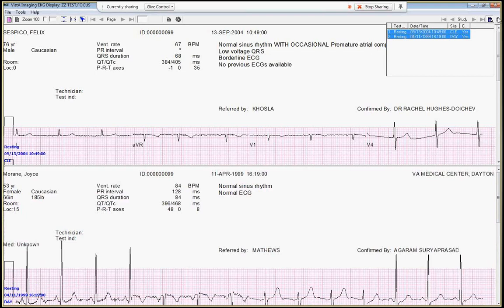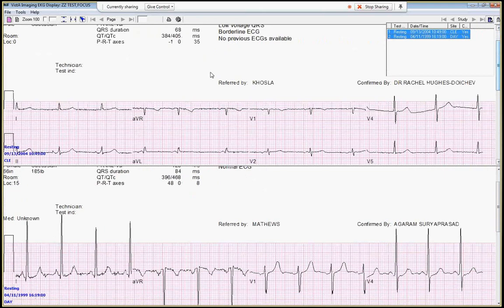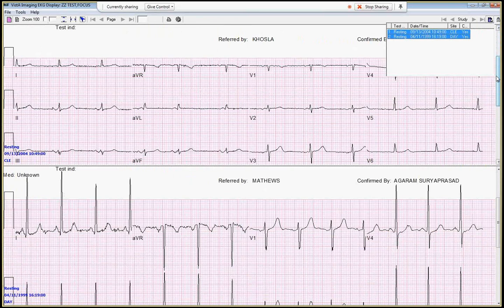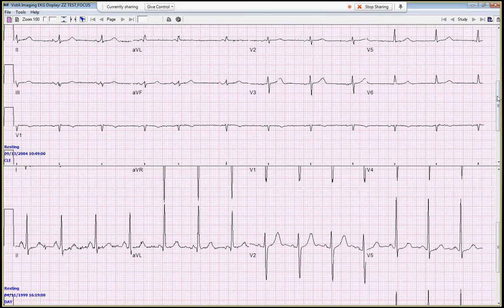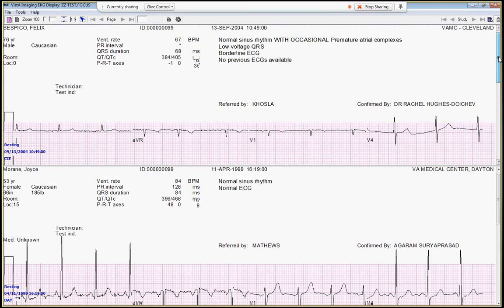The next thing I recommend is going to this little lock box and locking the scrolling, so that when you scroll one, they'll scroll together. You can look at individual leads — like V1 leads here together, V5 leads there to V5 kind of together. You can also click this away by just clicking that, so you can have more exposure to your EKGs. Then you can scroll up and down and they'll scroll together.